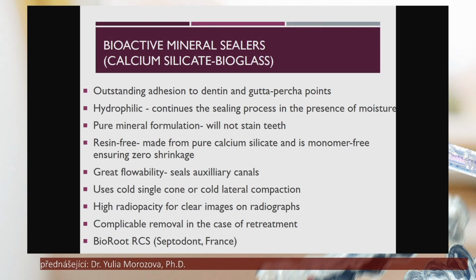They don't have resin. They are made from pure calcium silicate without monomer, and due to this, there is no shrinkage of these materials. They have good flowability, so they are able to seal some ramifications, some lateral canals.